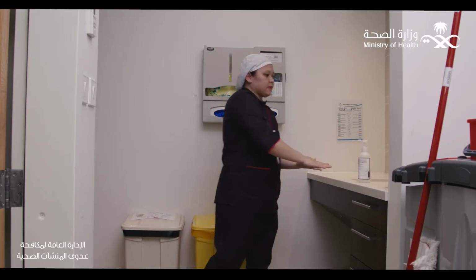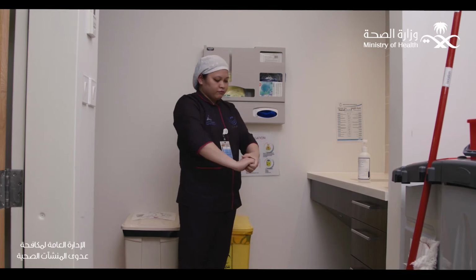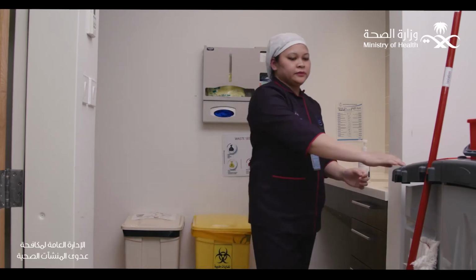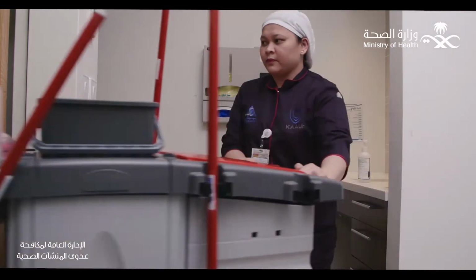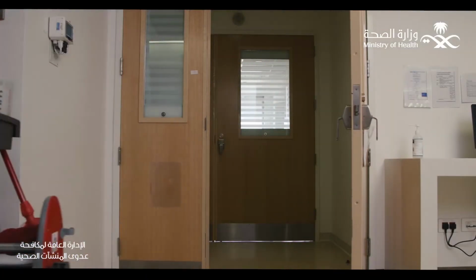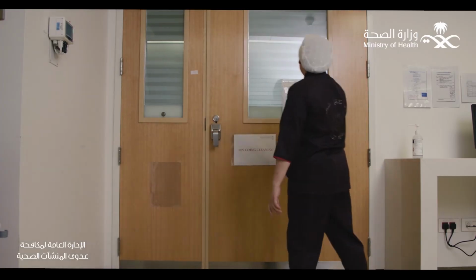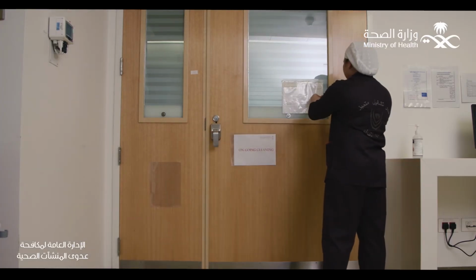Dispose of medical waste and wash the hands with soap and water. Thus the cleaner's task is over, and remove the sign, "The isolation room is undergoing cleaning and disinfection operations."